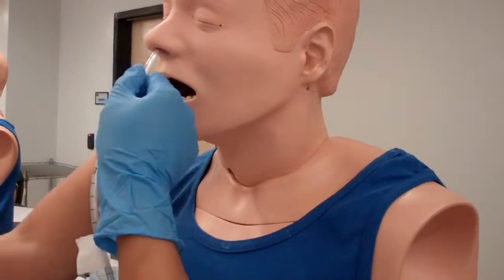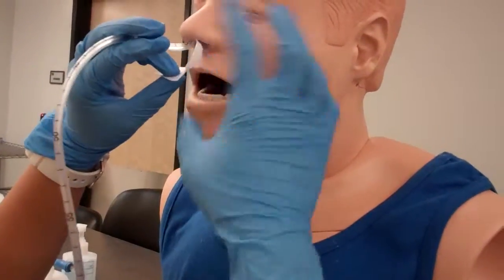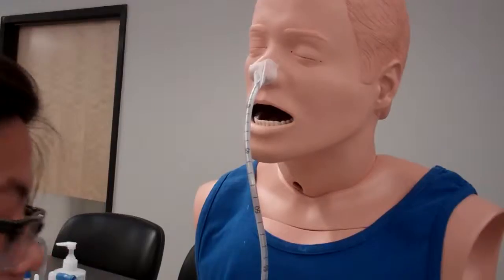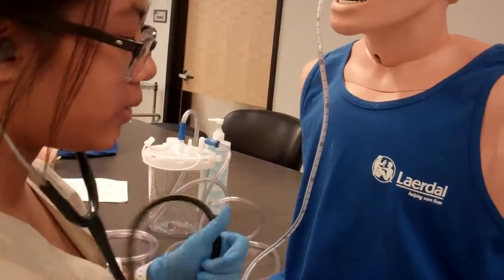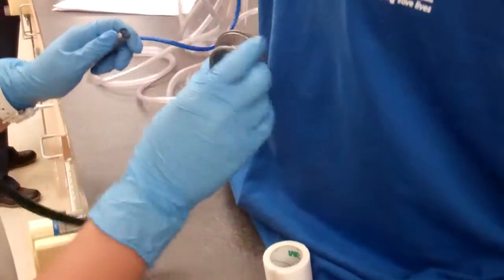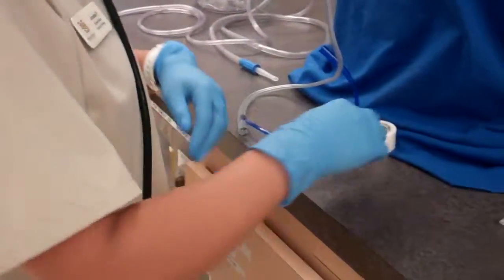Okay. So on this patient, I can only go up to 35 centimeters. So I'm just going to mark it at the 35 mark. Okay. Now I'm going to auscultate the stomach to make sure. So I would get a syringe and I would pull in 30 cc's of air and I would insert it into my tube and I'd listen to the stomach and I'd listen for air. Okay. And I hear air. So I have verification that the tube is in place.